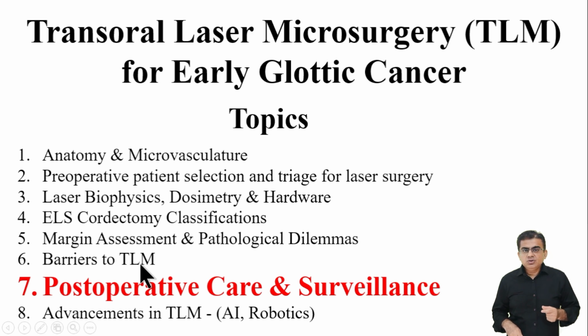You must routinely use tools like the laryngoscope in your clinic to predict difficult airway anatomy. You must be highly cautious with vertical tumor extension at the anterior commissure. And most importantly, you must honestly evaluate the true surgical expertise of your own hospital team. You must never push the limits of the laser if it risks a terrible functional outcome for your patient. If the surgical barriers are simply too high, you must confidently guide your patient towards primary radiotherapy instead.